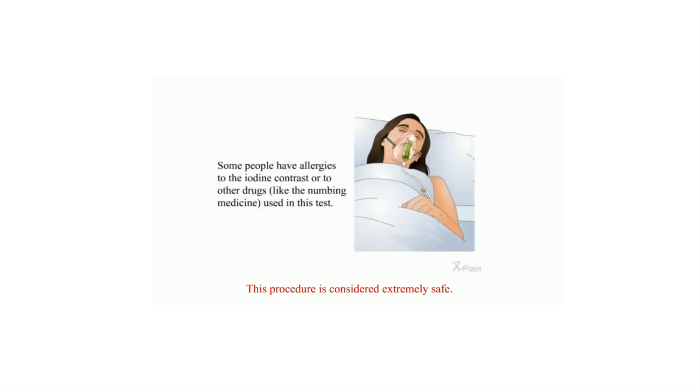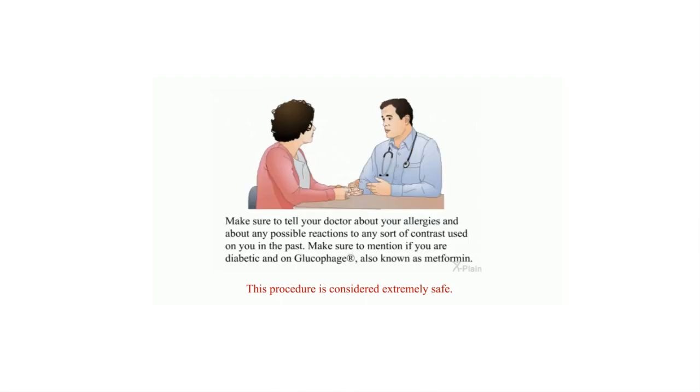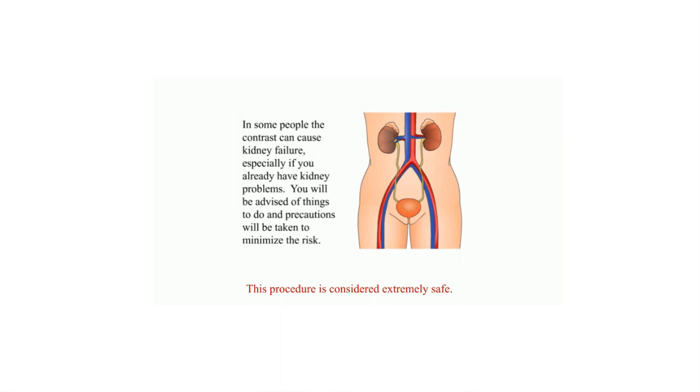Some people have allergies to the iodine contrast or to other drugs, like the numbing medicine used in this test. Make sure to tell your doctor about your allergies and about any possible reactions to any sort of contrast used on you in the past. Make sure to mention if you are diabetic and on glucophage, also known as metformin. In some people, the contrast can cause kidney failure, especially if you already have kidney problems. You will be advised of things to do and precautions will be taken to minimize the risk.